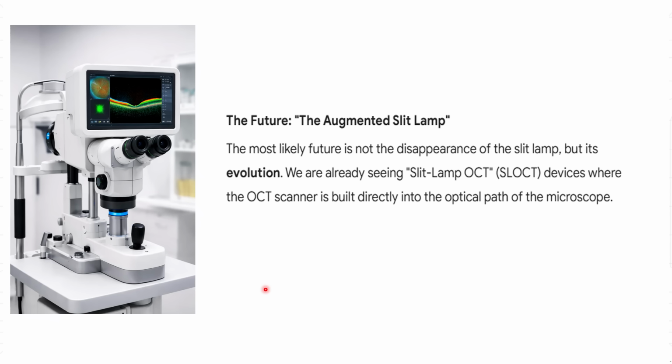But there will be augmentation for this slit lamp. There will be enhancement of the slit lamp by the integration of the OCT into the slit lamp like this. So there will be a slit lamp integrated with an OCT, so that you will have both subjective evaluation as well as objective evaluation.